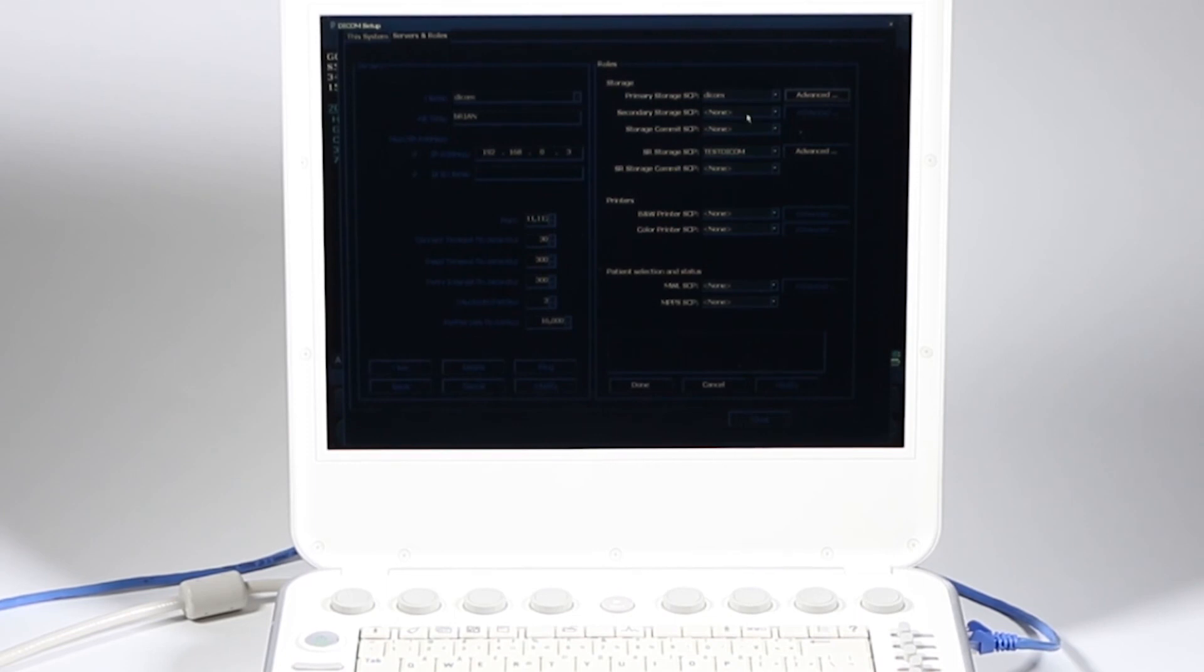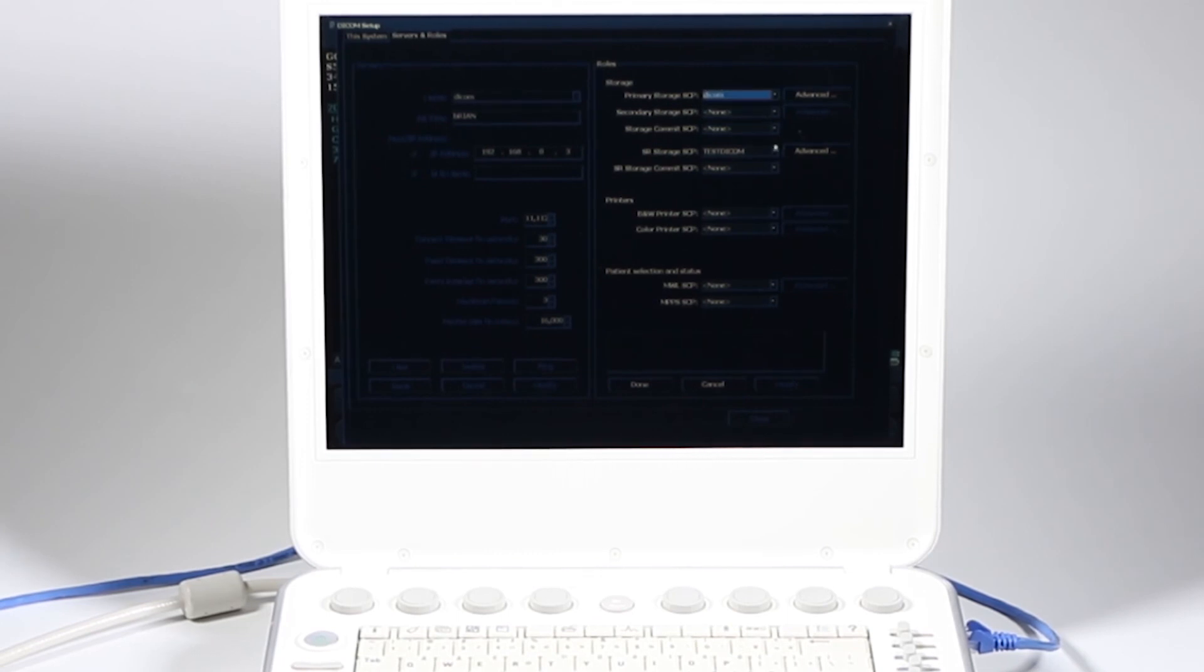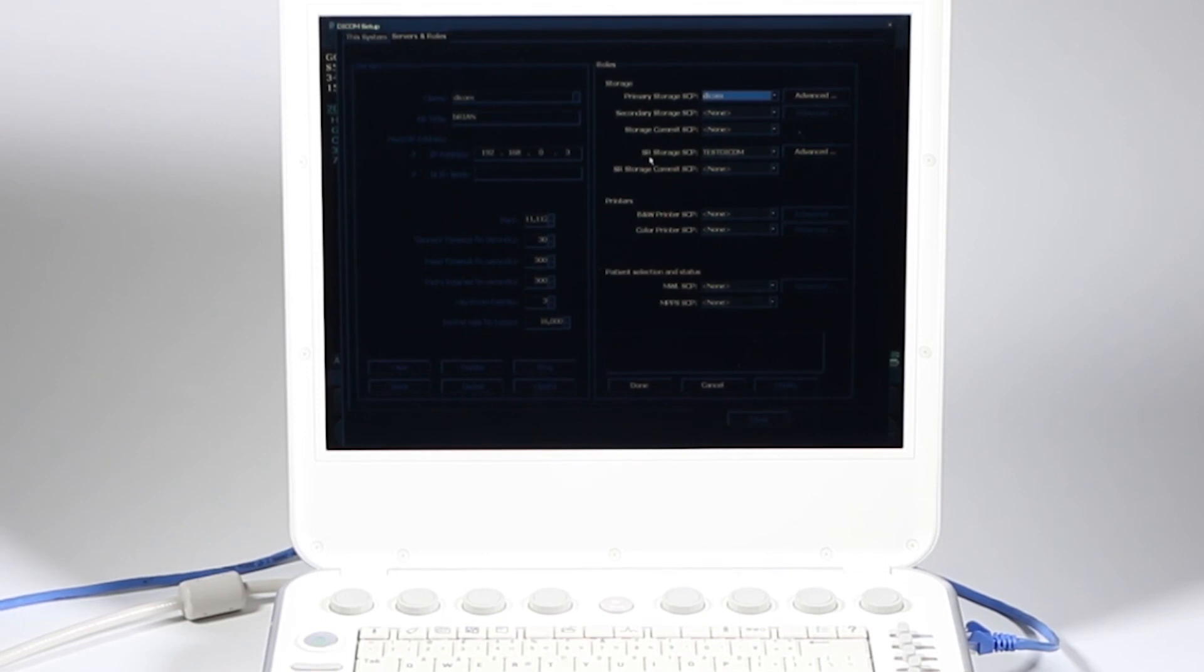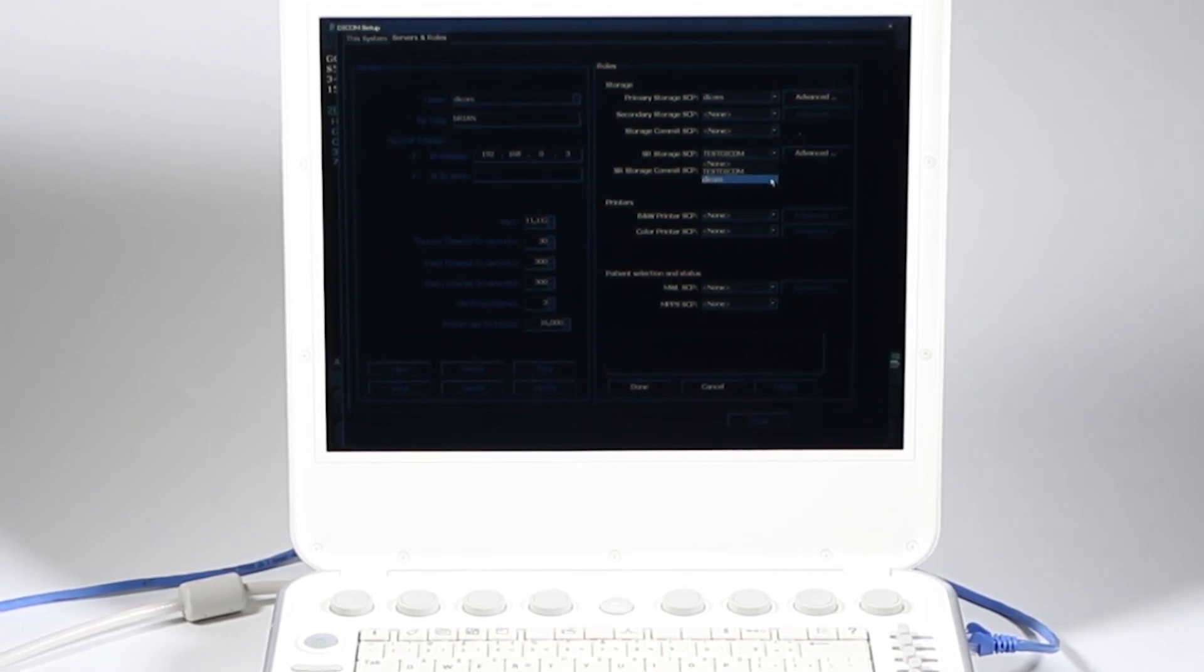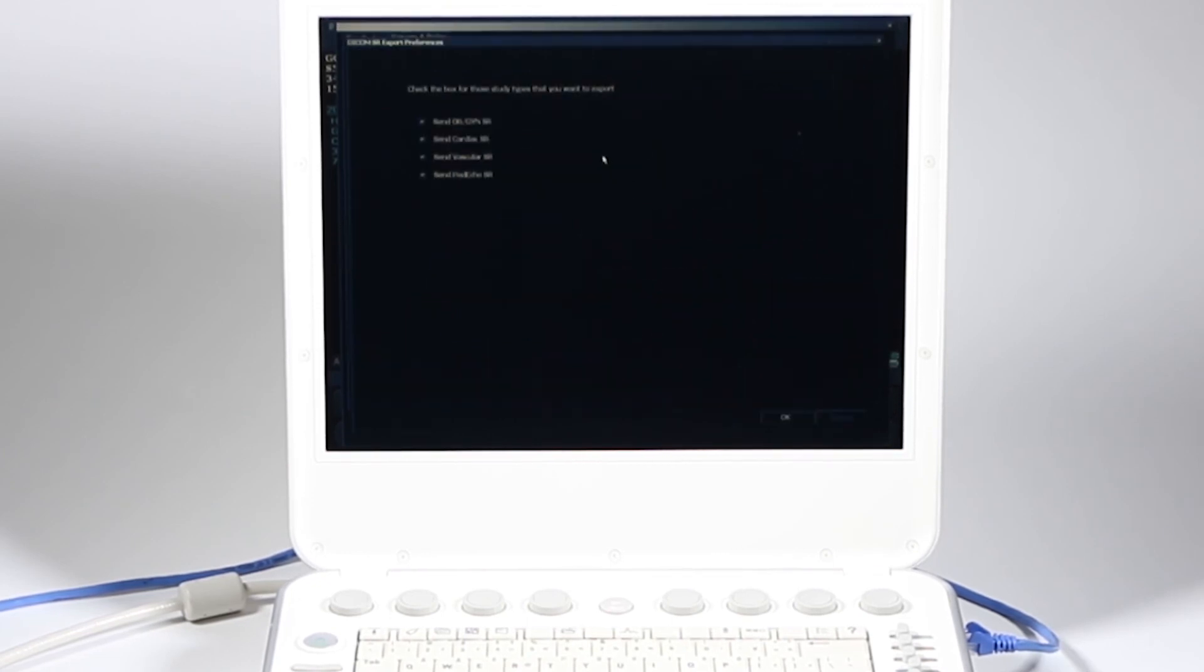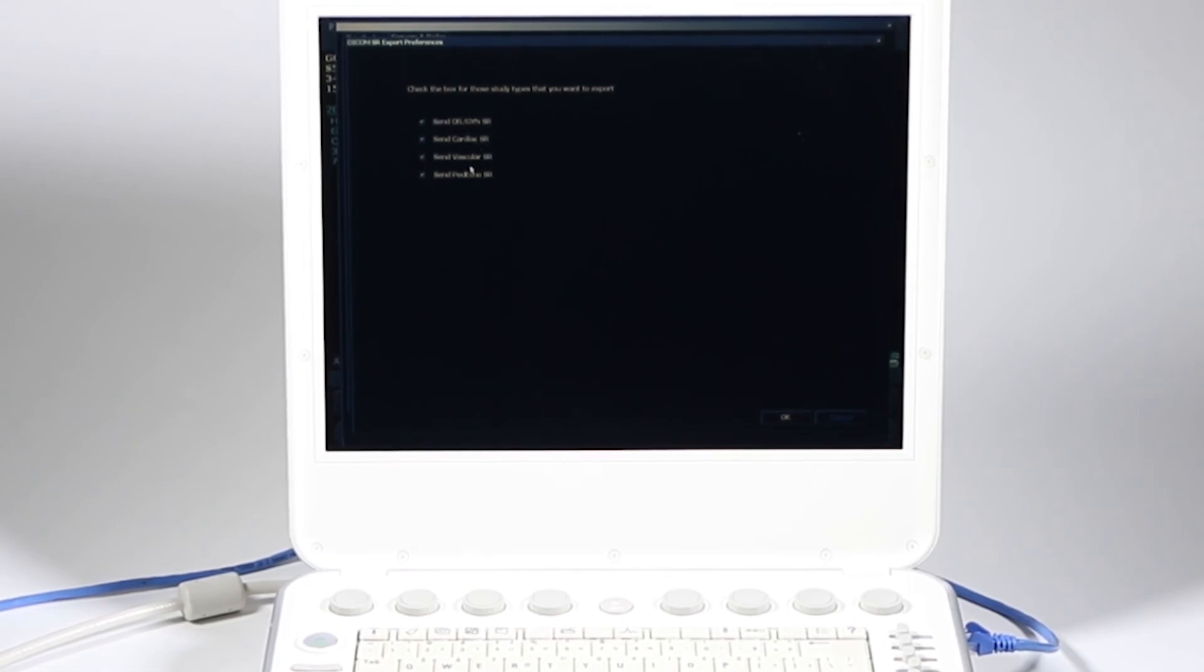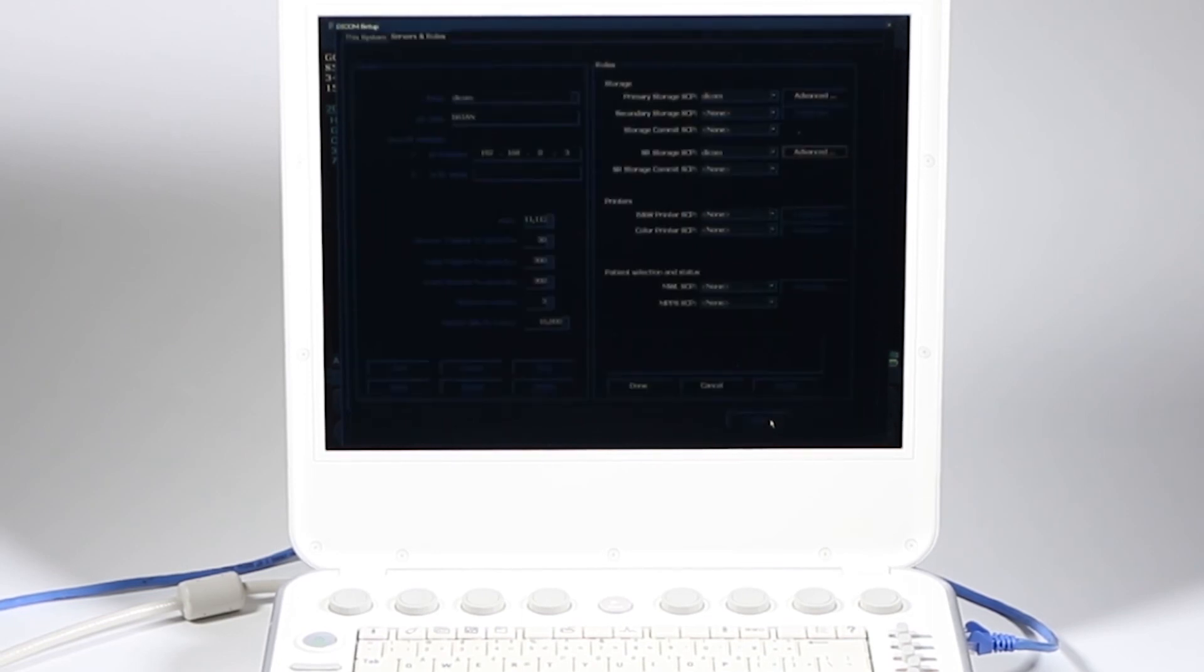So now primary storage, each time I save or export, do I want to go to that previous server? I want this DICOM one. SR Storage SCP, this is your structured report. You want that to go, so choose DICOM for SR Storage SCP. If you are needing to send structured reports, click on your advanced. Do you want to send? Yes. Go ahead and just keep them all checked. If you're doing all those, it'll go with your patient report. I'm going to click OK.